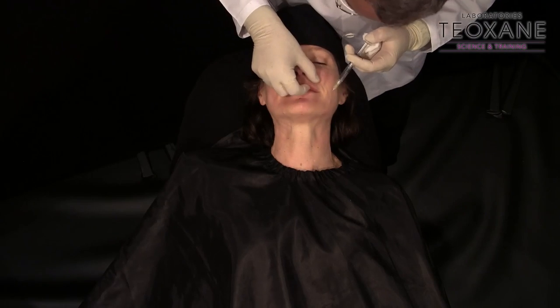You can see the eyes are much more radiant. They're sparkling, because you had the shade, sort of shadows around the eyebrow. Now you got the light coming back. You reflect the light differently. Chin area is much better. The projection of the chin matches the nose, lip, chin area. The angle is correct. Smile. Just a tiny, tiny adjustment too.